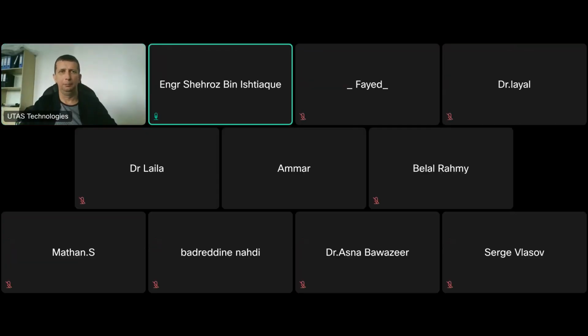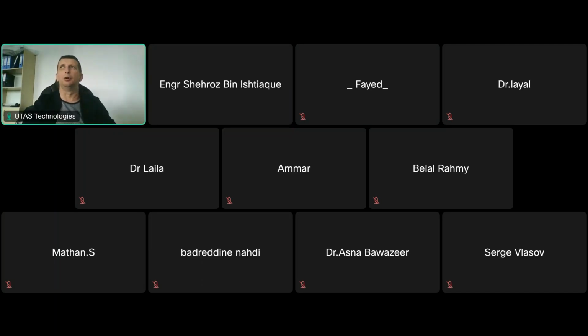Then we need to set the mode, after putting in the height, we need to set the mode of AVent or ProVent for the patient. If any nurse can put the height or weight of the patient, does the ventilator sense itself, or does she need to select the mode? In any case, the mode needs to be selected.